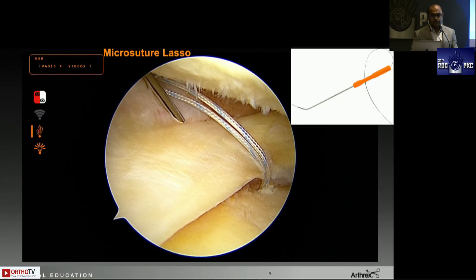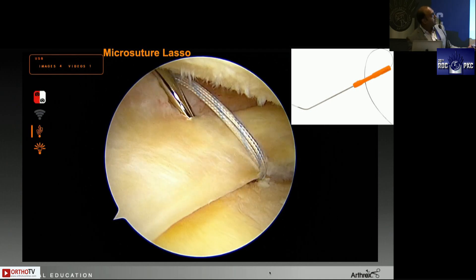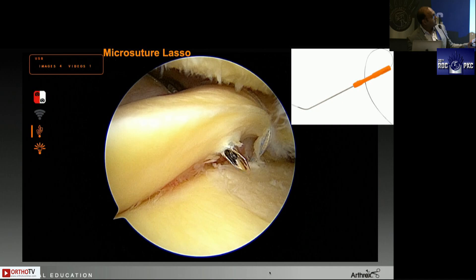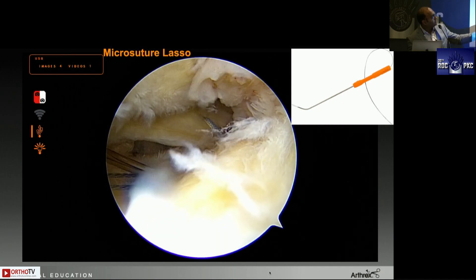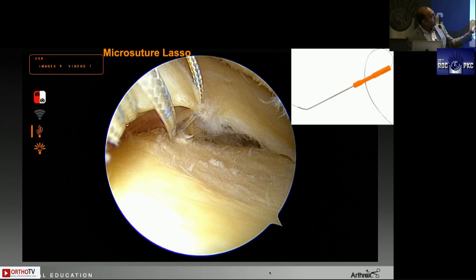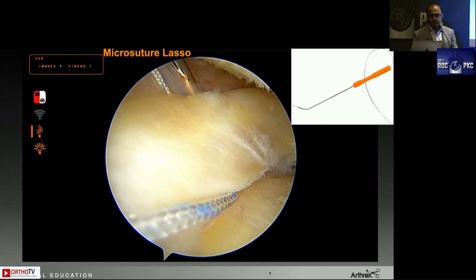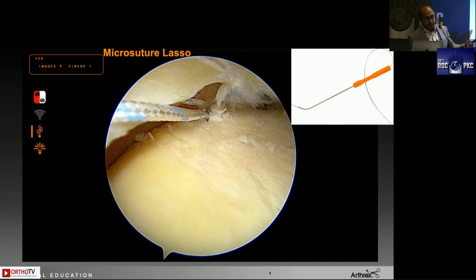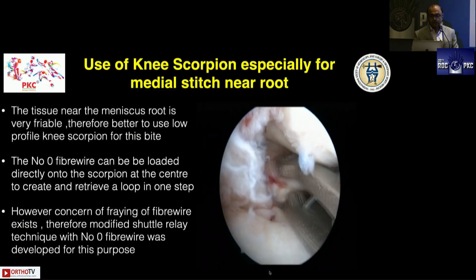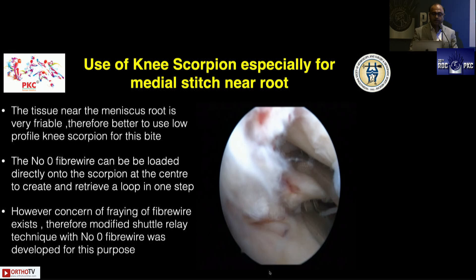Quickly about the micro suture lasso — this is very useful in my practice. This is a left knee medial meniscus where the root repair has been done, sutures pulled into the tunnel, and a knot tied. I've placed an anchor for centralization. The micro suture lasso comes in two variations: straight and curved — the curved one works beautifully to retrieve sutures at the meniscus-capsular junction to create a centralization stitch.